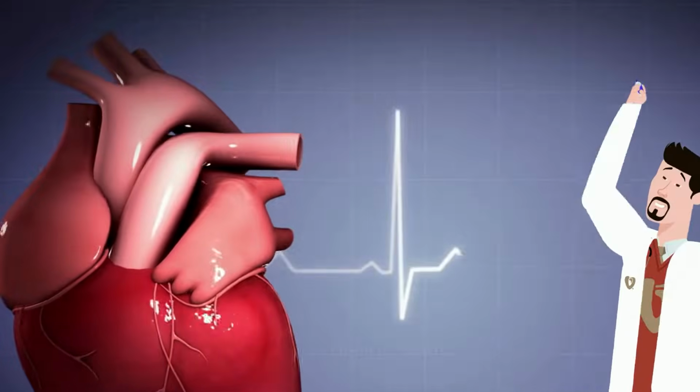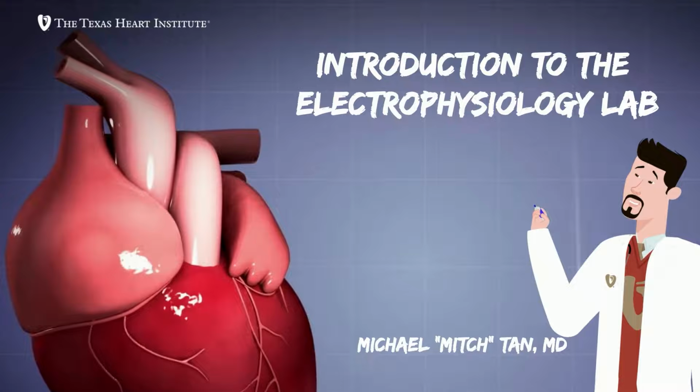This video series is designed to introduce concepts relevant to the EP lab and electrogram interpretation, and to do so in palatable bites, ultimately building to you practicing electrogram interpretation on your own. My hope is that by slowly layering on detail and understanding, the basics of electrophysiology will seem easy by the end of the video. Now time to start an introduction to the EP lab.